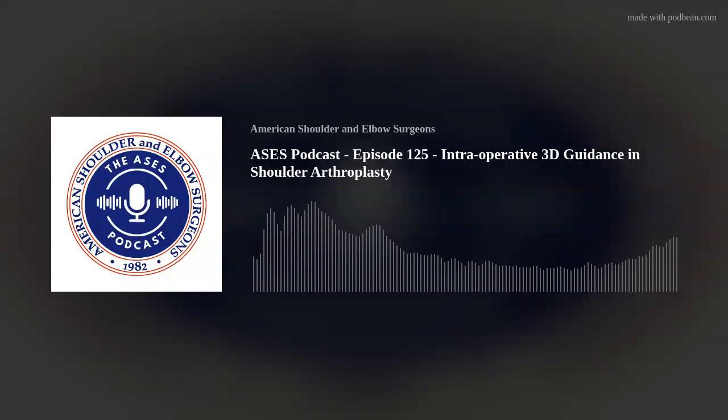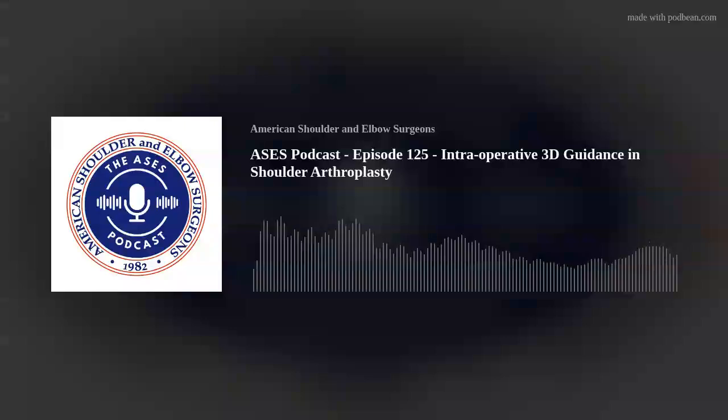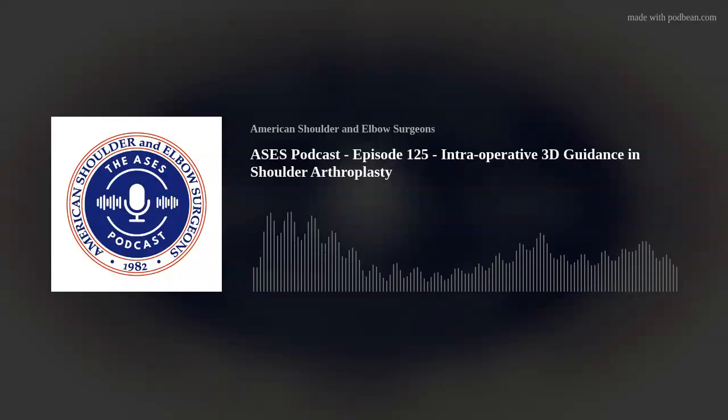Yeah, so first of all, with regards to anatomics, the first thing for me, I'm sure it's the same for all of you, is to understand the exact nature of the pathology. If you have a significant degree of subluxation, posterior erosion, and you're getting to a B3 stage, I probably won't do an anatomic total shoulder arthroplasty unless I'm willing to do a large wedge correction, which I'm not at this point in time, because I'm not sure that's the right way to go, and the evidence is not completely clear on that. But when it comes to a routine anatomic total shoulder arthroplasty, which is concentric wear, not significant erosion posteriorly, and not subluxed, I just use Professor Walsh's golden rules, and I try and plan my operation through those principles.